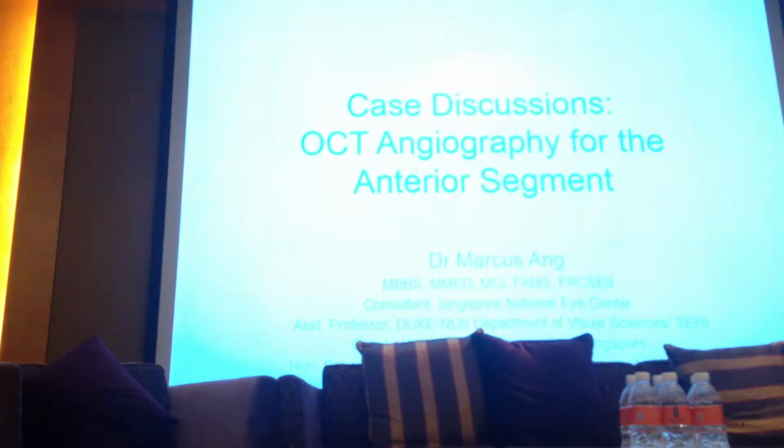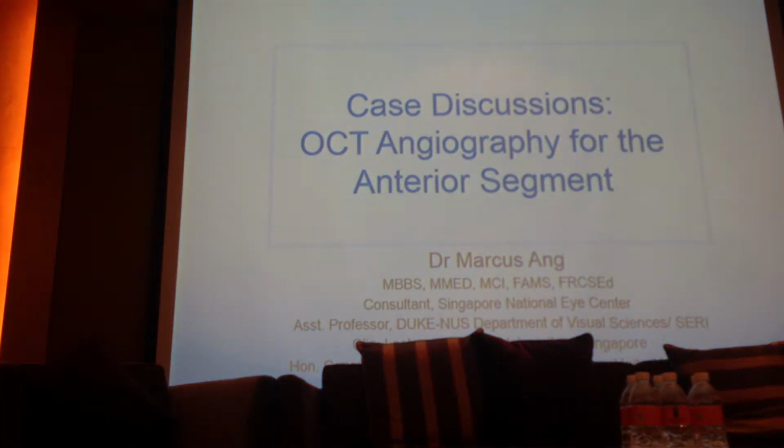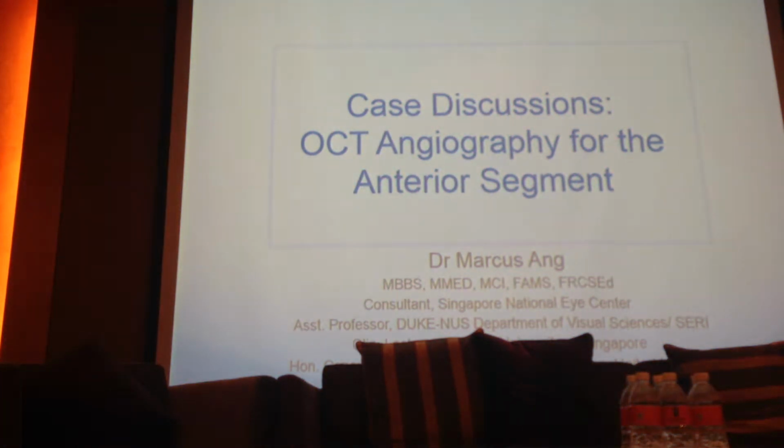So I think I spoke a little bit about how we could potentially use the OCT A for the anterior segment, and today I'll be just showing some case examples on how we can use it in a practical sense. I didn't really have time to go through all that yesterday.